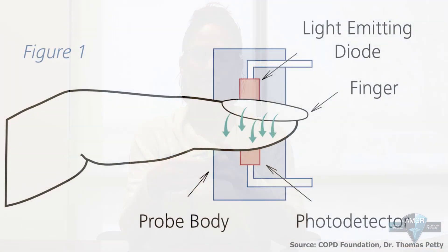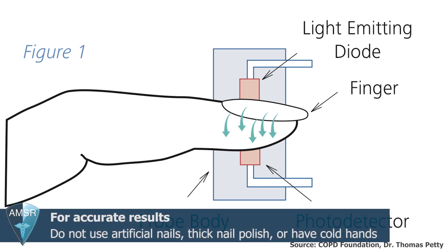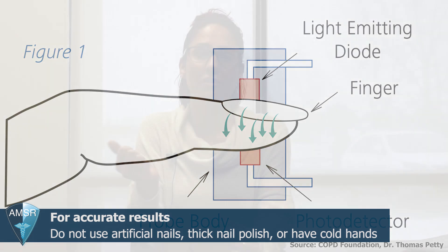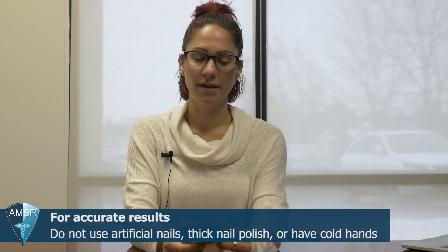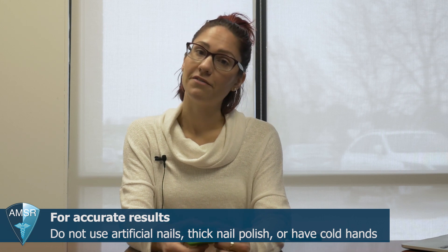We're going to open it up, slide your finger in, and then it's going to start reading your saturation levels. Something to know: if your fingers are really cold, or if you have thick nail polish or artificial nails, the pulse oximeter may not work for you. But fun fact — you can actually attach it to your toe or even your nose. But we'll use the finger for today.